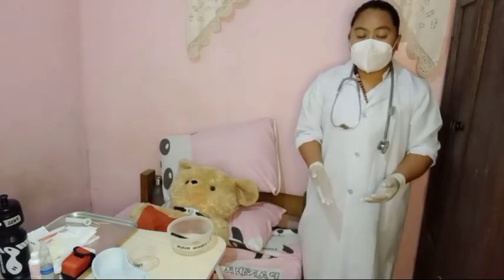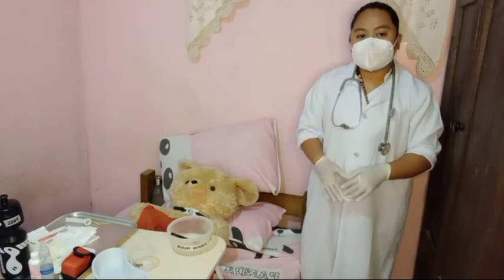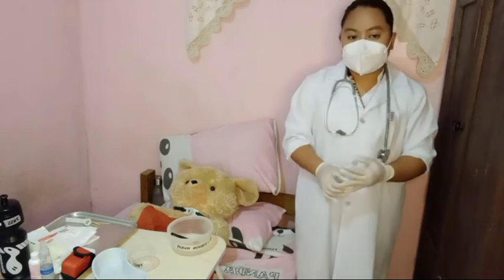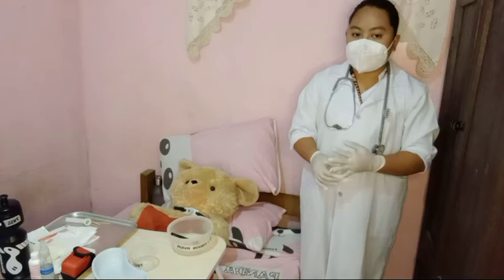And then dip a cotton applicator or gauze sponge in a cup or basin with sterile saline and clean the stoma under the face plate. Use each applicator or sponge only once, moving from the stoma side outward.